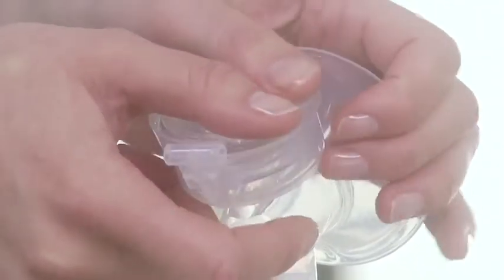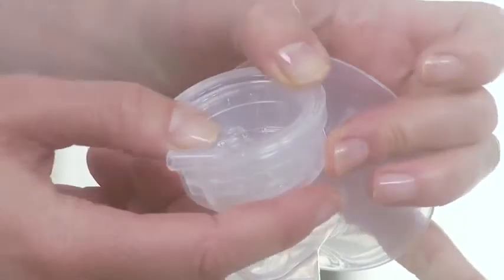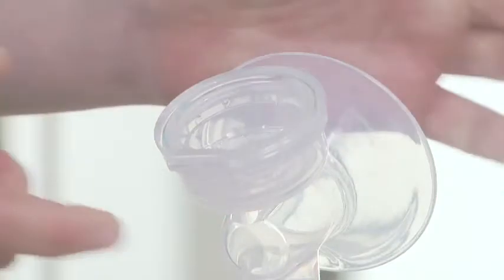Place the silicon diaphragm into the pump body from above. Make sure it fits securely around the rim by pressing down with your fingers to ensure a perfect seal.